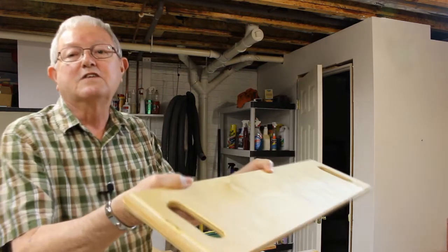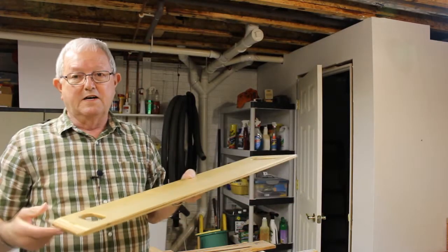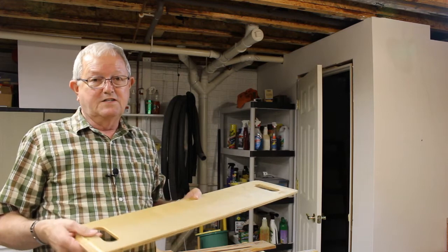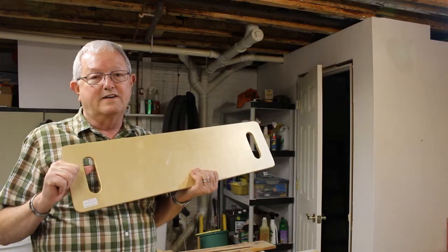As you can see, the edges are beveled. She would like me to cut a new handle and bevel it. So this is a simple project, I think. Stick around and we'll get it done real quick.